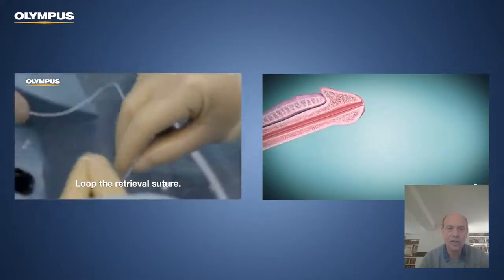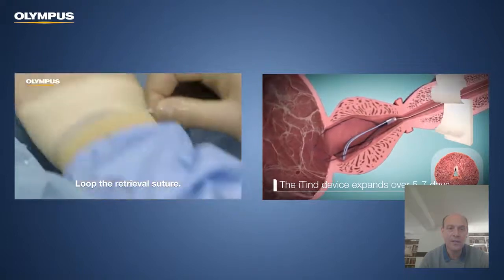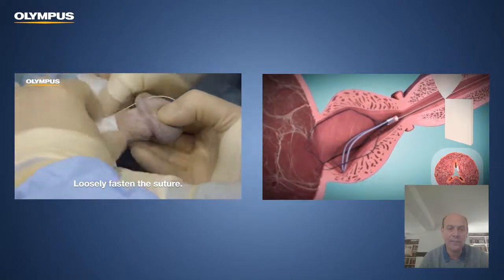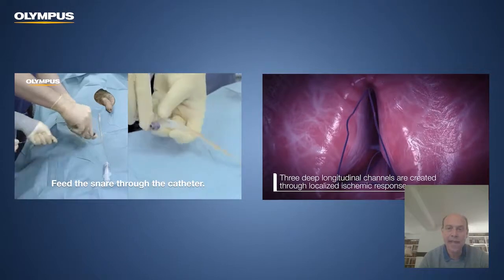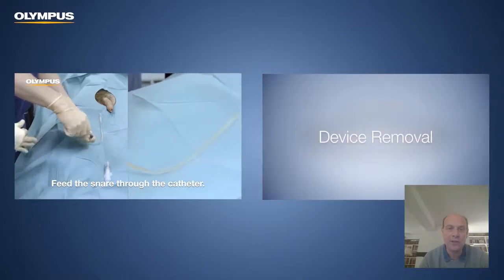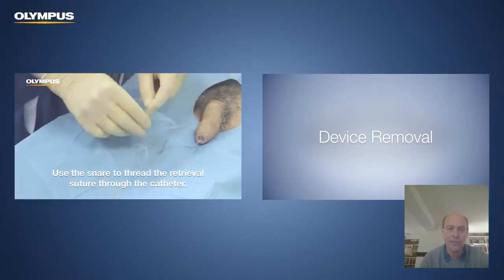The retrieval suture is looped and taped to the penis for use when the patient returns for retrieval in 5 to 7 days. During that period of time, the torque within the device pushes out in the 12, 5 and 7 o'clock positions along the struts to create the longitudinal incisions through the bladder neck and prostate.